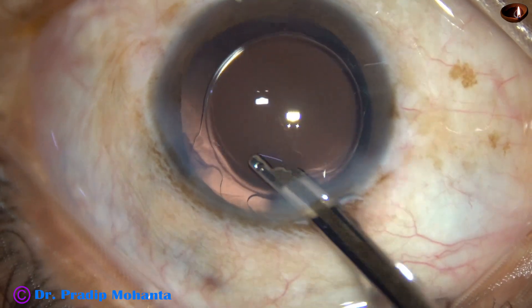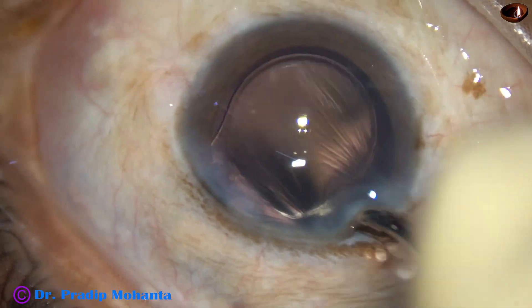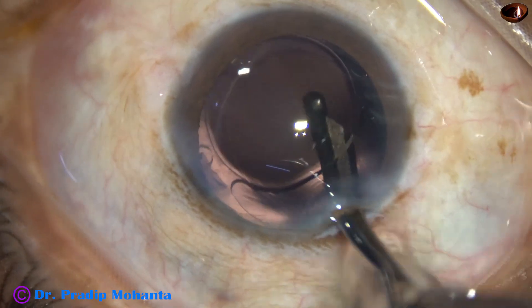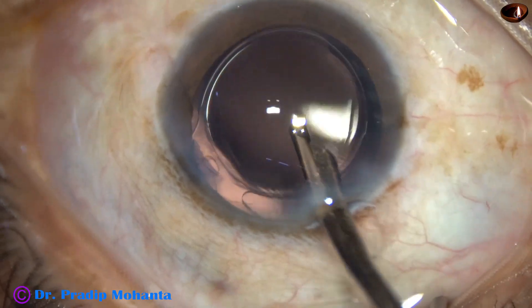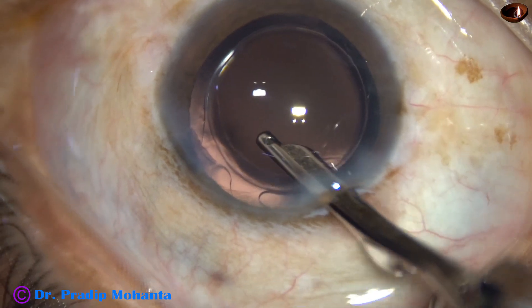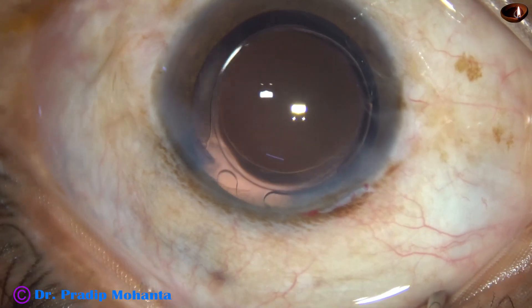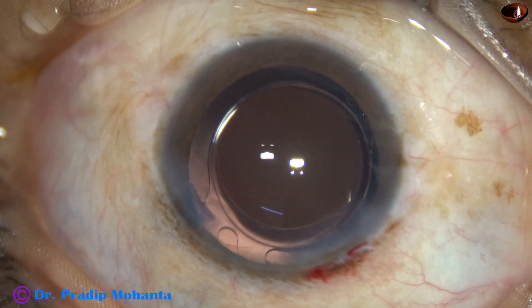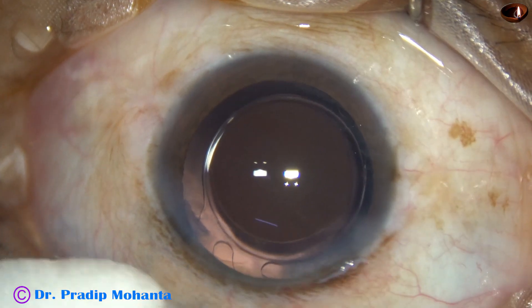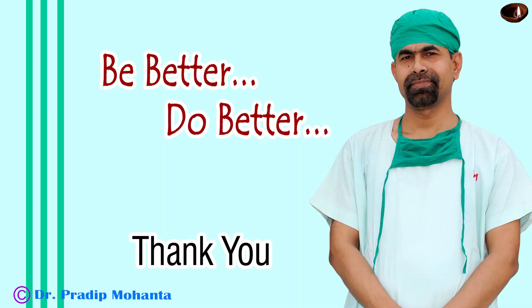Now, this is the final lavage of the anterior chamber. At this time, whatever visco is sticking to the corneal endothelium is removed. The bag is also irrigated. The anterior chamber is then very nicely formed. The integrity of all the wounds is checked. A few drops of moxifloxacin is applied over the cornea and the case is concluded.